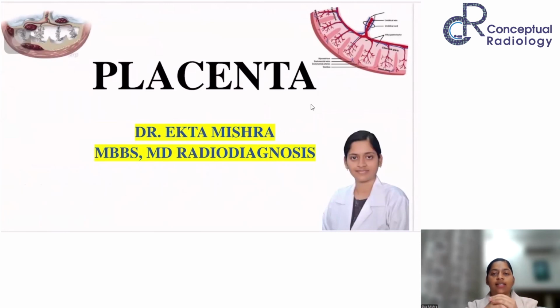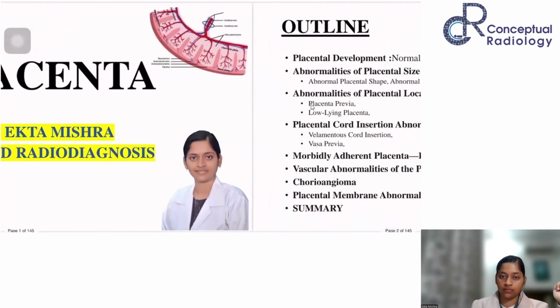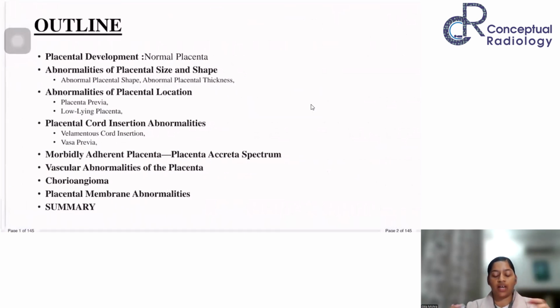Today we'll be discussing in detail about placenta. So the outline of class is, we'll start with the placental development and discuss in brief about the normal placenta and how it appears on sonography and MR imaging. Okay, then we'll discuss the placental size and shape abnormalities.